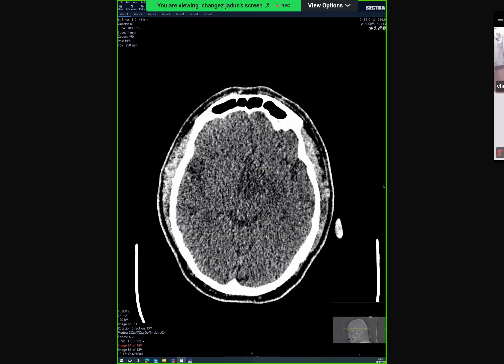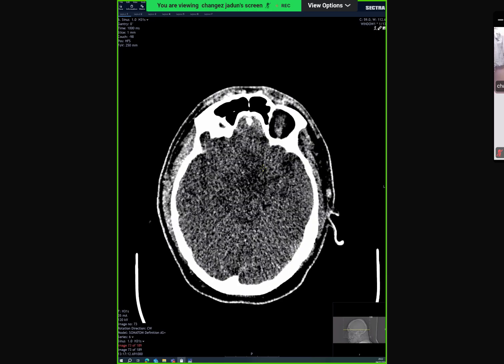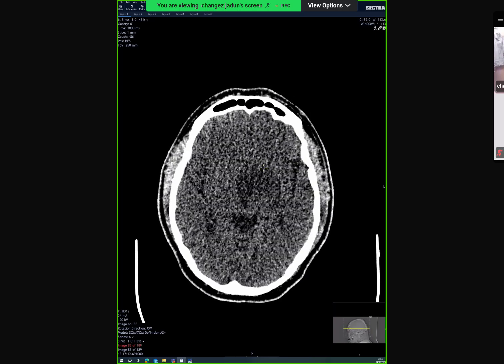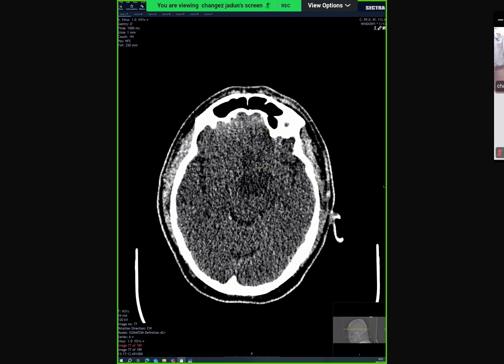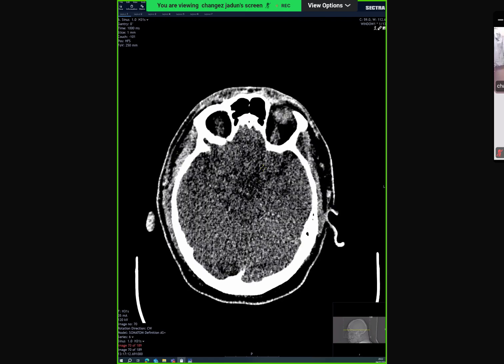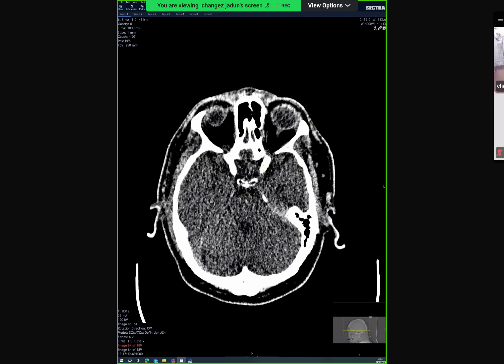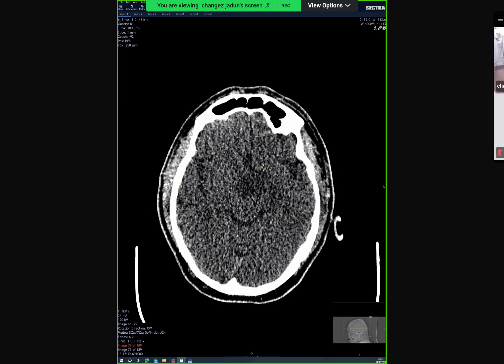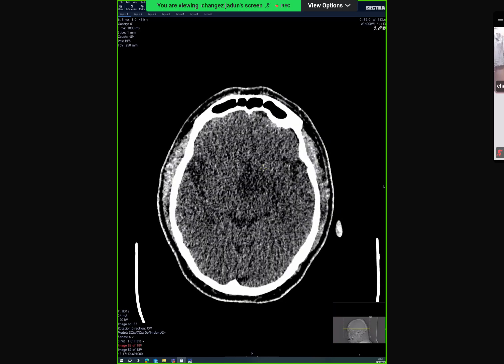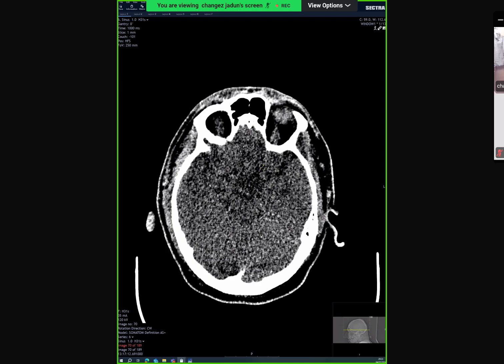I will change the window a bit. There is some hypodensity at the left basal ganglia. You can see a low attenuation in the left basal ganglia in that region. What else do you want to see? Remember, whichever study you have, you have to get the maximum out of that study.